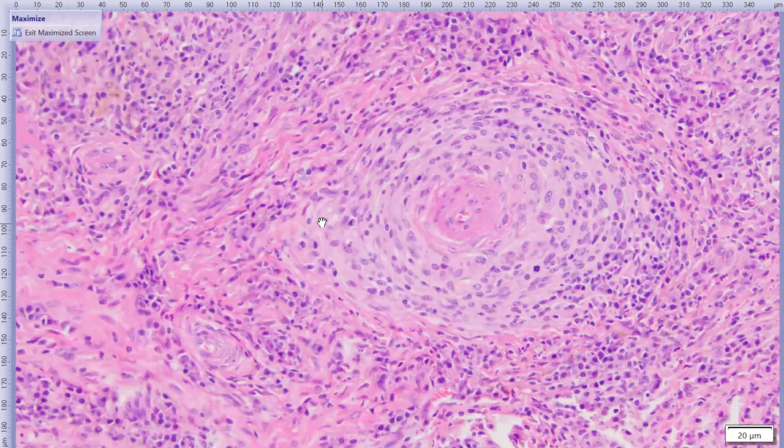So this is synonymous, clinically speaking, with what some people call necrotizing scleritis. This case happens to also involve the cornea, which is a little bit unusual. Oftentimes it will stop right at the limbus, and sometimes it will be specifically only affecting the cornea. What we're seeing here is the histiocytes whirling around the blood vessel.